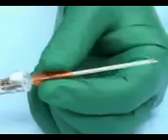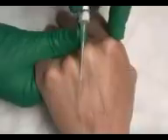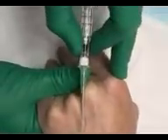If fluid extravasation or thrombosis occurs, remove the cannula immediately and place a new line if needed. The chances of successful peripheral intravenous cannulation increase with meticulous attention to proper technique, the use of proper equipment, familiarity with anatomy, and a knowledge of a variety of approaches to accessing peripheral veins.